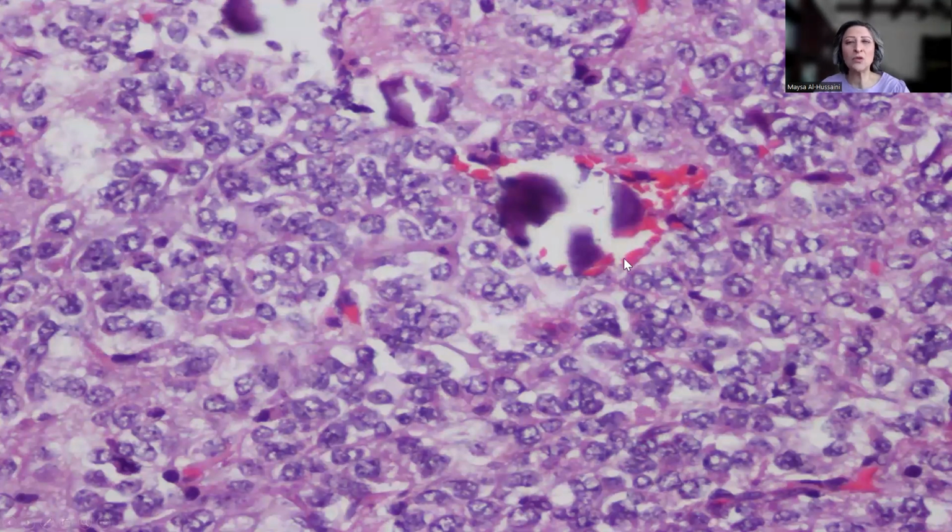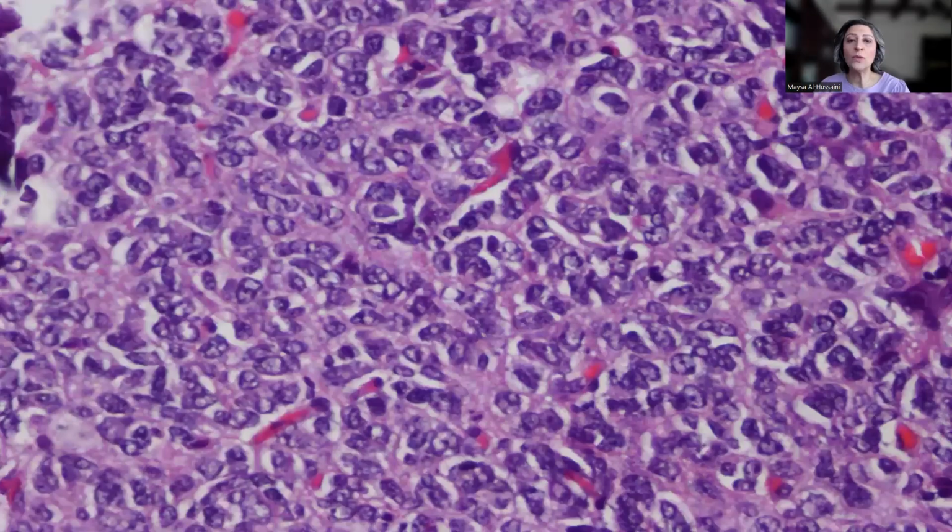So we're talking about the morphological features more or less similar to oligodendroglioma, and other more cellular areas, perhaps a mitotic figure here. Really, all in all, the appearances would be very much suggestive of oligodendroglioma, probably the anaplastic or a grade 3 oligodendroglioma. But we have to prove it by immunohistochemistry or other molecular testing as per the recommendation by the WHO 2021 classification.